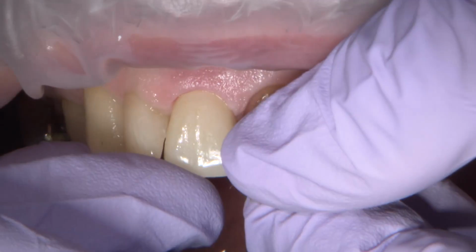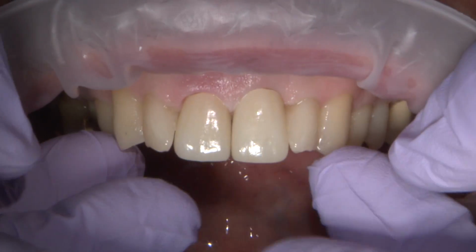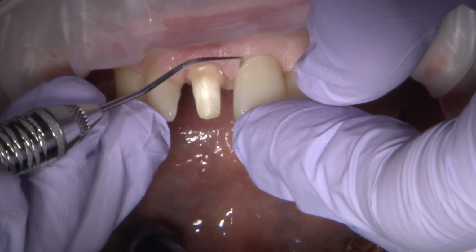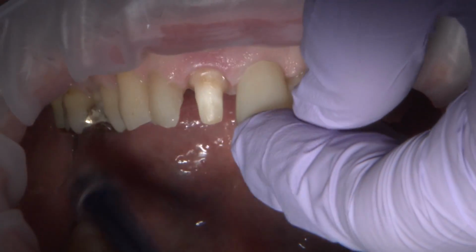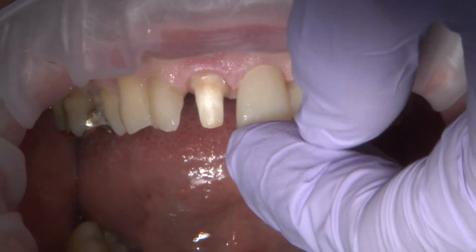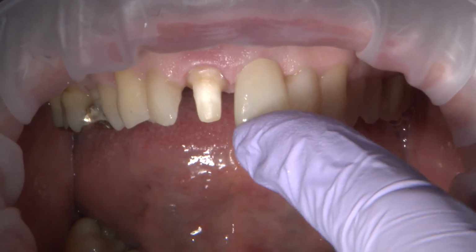I try in 8 and 9 to confirm the midline position initially, just to get an overall look, and then I'll try them in individually just to ensure that the margins are nice and closed and sealed and flush to the preparations. With these monolithic restorations, the margins really adapt extremely well to the preparations.